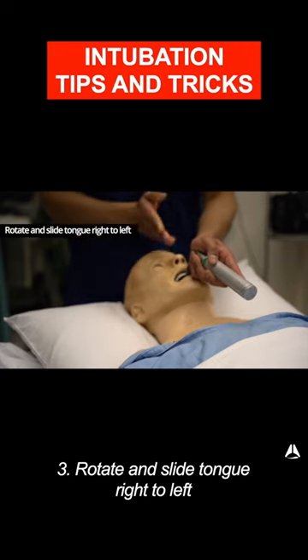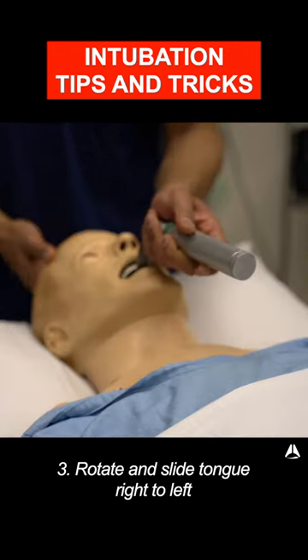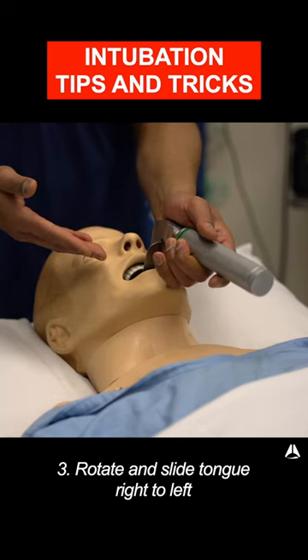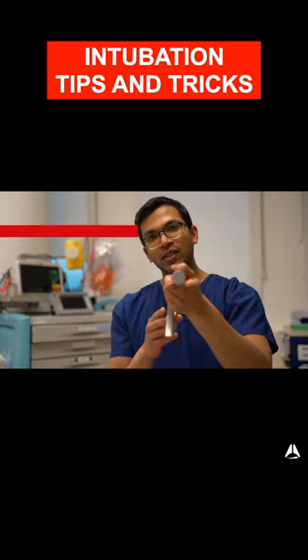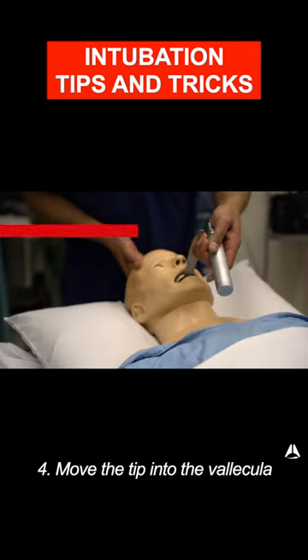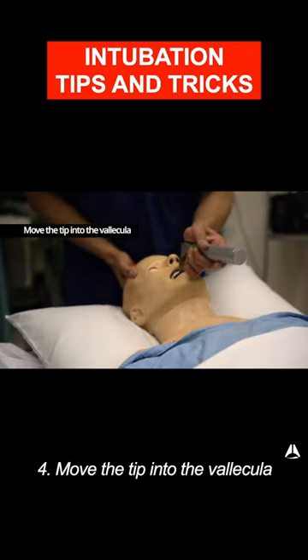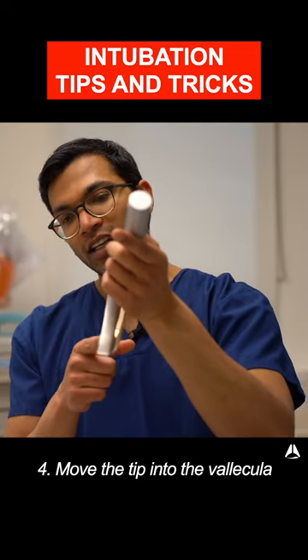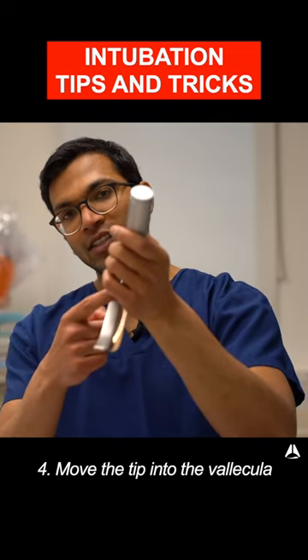The very next step: slide the tongue from the right to the left. At this point I'm pretty much going straight back into the oropharynx. Then I do a tilting motion — what I'm trying to do is get that tip and just trace down the tongue. The tongue is the road down to the vallecula, and I need to go all the way down into the vallecula, tilting on this axis.